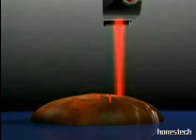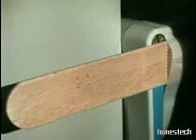The beam penetrates deeper in a highly hydrated tissue, such as Reinke's space, and less in a denser tissue, such as the keratotic epithelium of chronic hypertrophic laryngitis. It's appropriate, therefore, to modulate the theoretical depth of the incision according to the incised tissue, for example a 2 mm deep incision for the epithelium and then a 1 mm incision for Reinke's space.